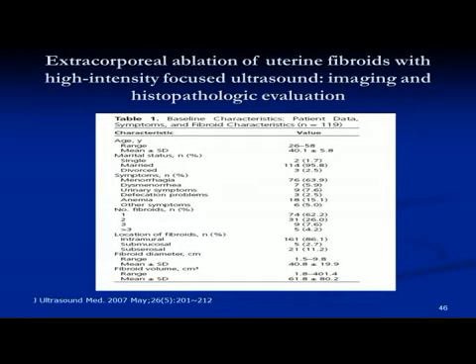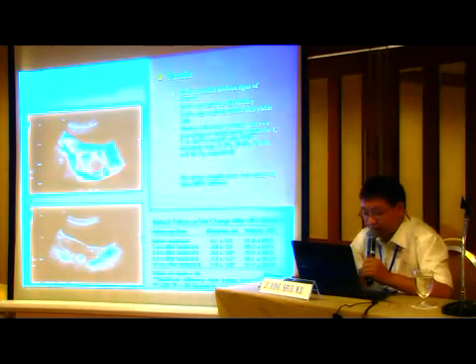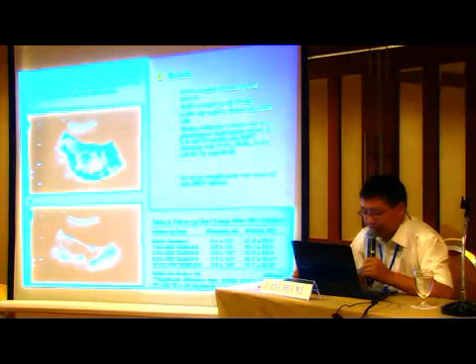These are a group of tumors with symptoms, the volume of which reduced after treatment with HIFU. Among my patients, some volumes reduced by more than 80%. Since the volume is calculated from the diameter, if the diameter reduces by half, the volume will be 1/8 of the original, which is a reduction of nearly 90%.